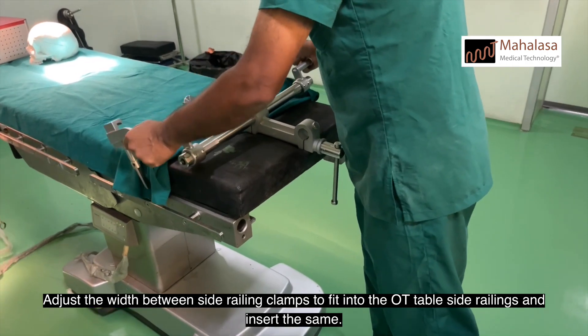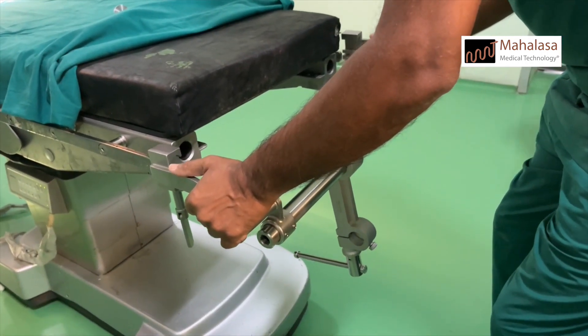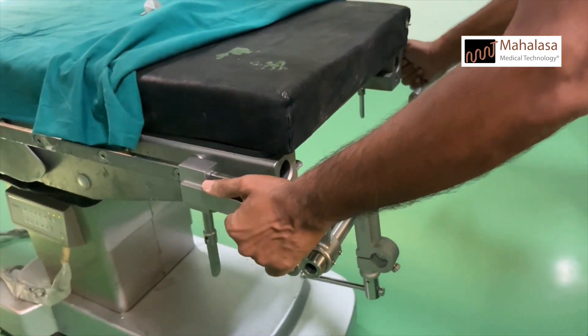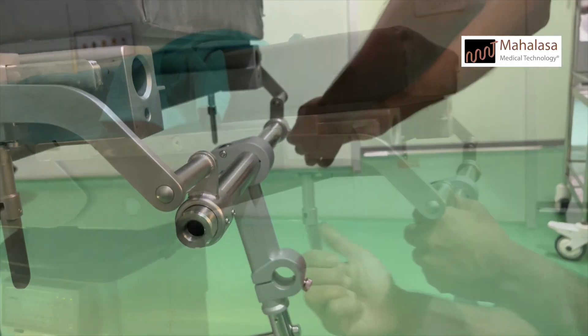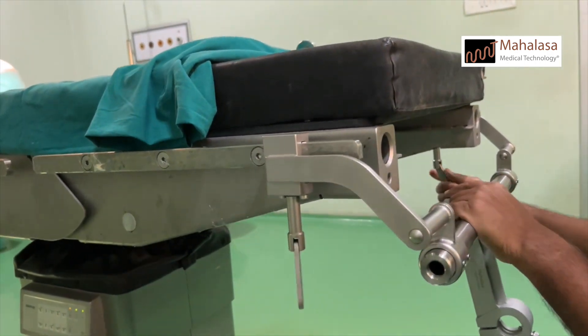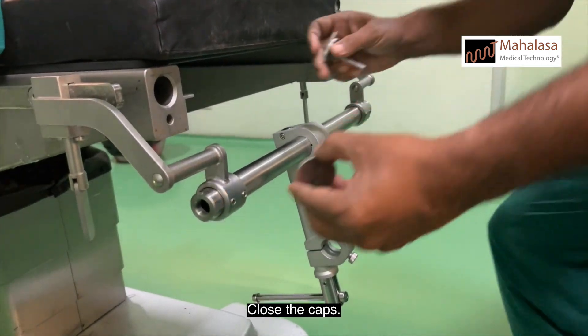Adjust the width between side railing clamps to fit into the OT table side railings and insert the same. Lock the grub screws. Lock the bolts on both the sides firmly. Close the caps.